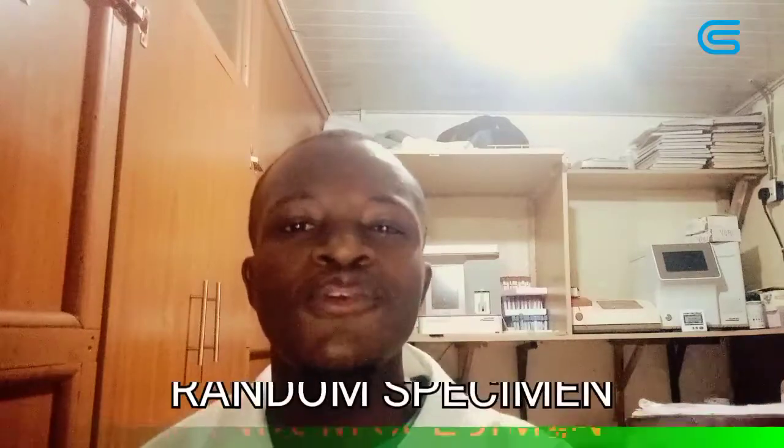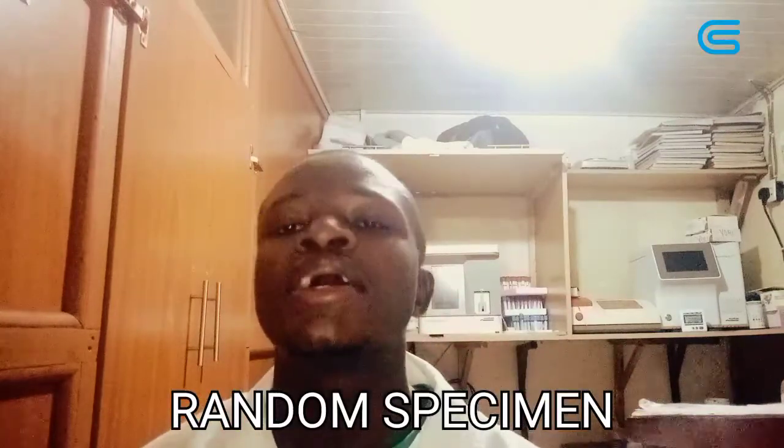So we also have what we call the random specimen. This is a specimen obtained during any time of the day. Any time of the day you are sent to go and bring your urine sample, we will call it the random specimen. It is the most convenient and the most common type of specimen that we obtain in the lab. It is good for chemical screening and also microscopic examination.